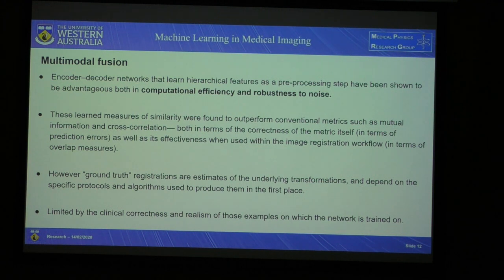registration workflow. However, ground truth registrations are estimates of the underlying transformations and depend on the specific protocols and algorithms used to produce them in the first place. So therefore, it's limited by the clinical correctness and realism of those examples on which the network is trained.